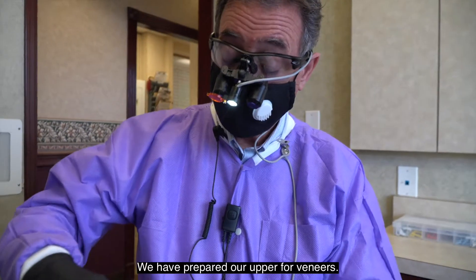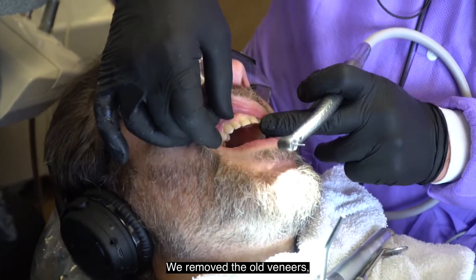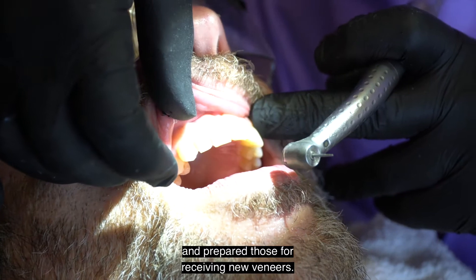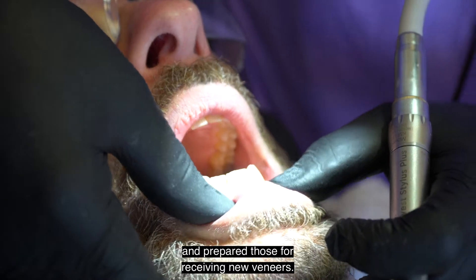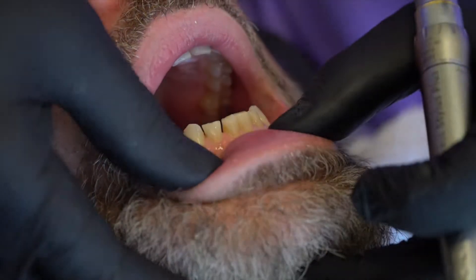Here we are — we have prepared our upper four veneers. We removed the old veneers and prepared those for receiving the new veneers. Now we're about three quarters of the way through the preparations on the lower.